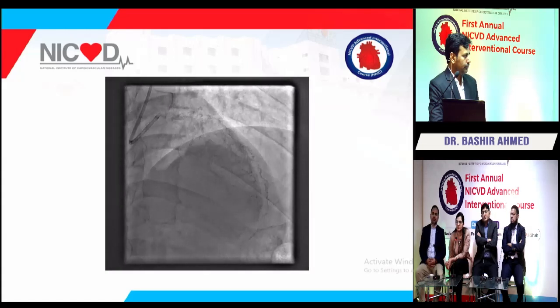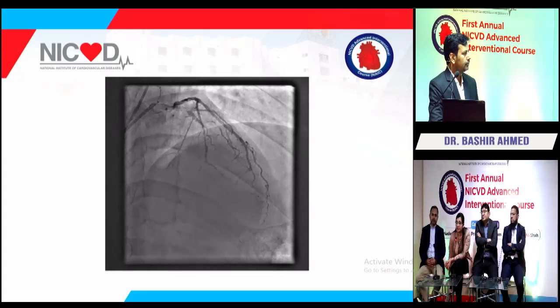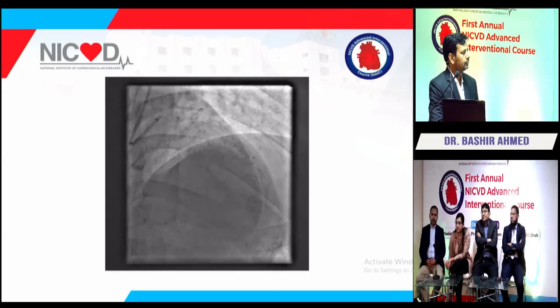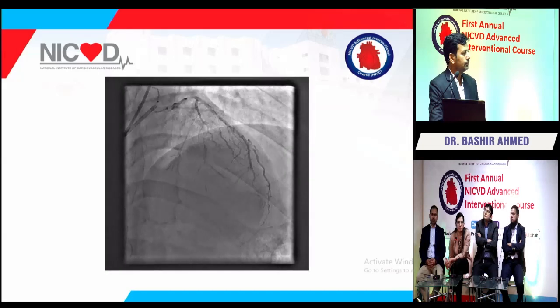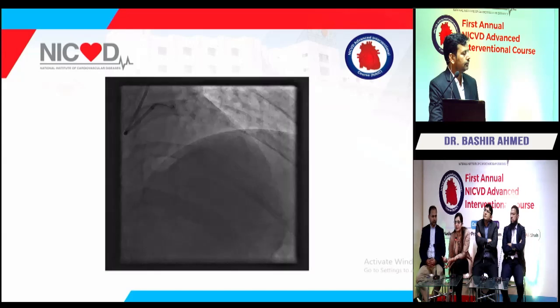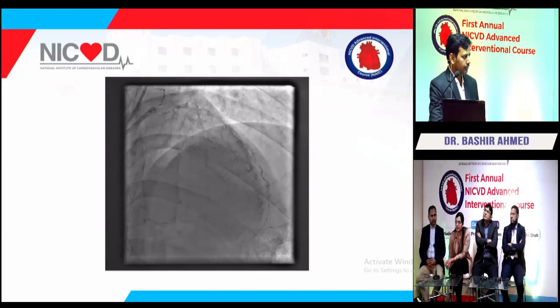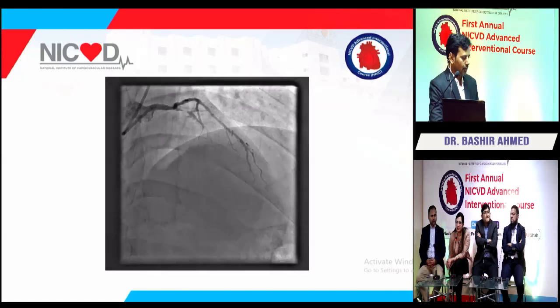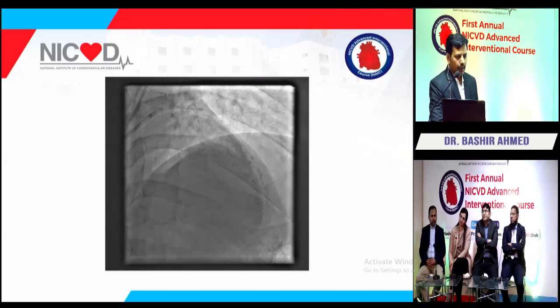Relative contraindications also: if the patient has a low EF and it's the only surviving artery, you would not do rota. Some other relative contraindications would be if you do not have cardiothoracic backup, if the patient is in shock, or has poor LV. Okay, Dr. Romana, I got your opinion regarding this.